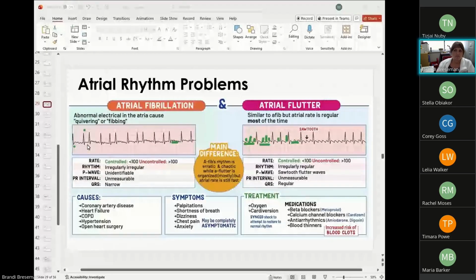However, if my patient is unstable and showing signs of poor perfusion, I can't do that. I can't give them a sedative or something to help them relax, because they're probably coding at that point. So for those patients, unfortunately, we are just going to shock them, and it hurts.